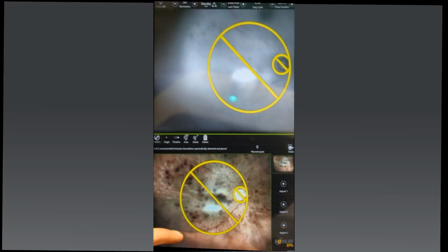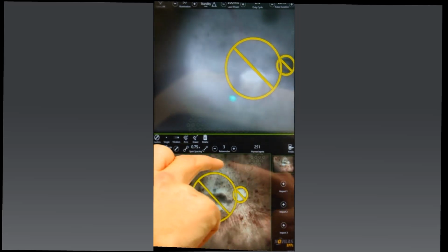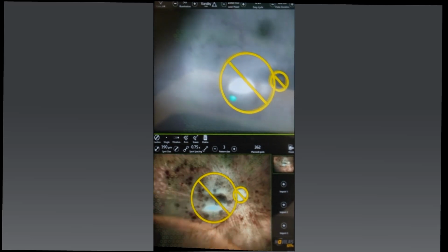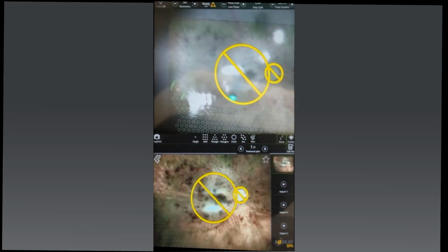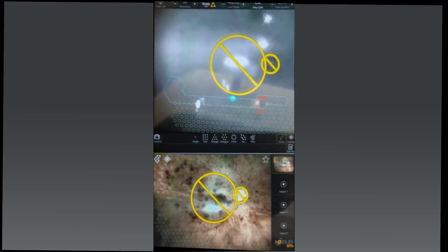This is a very ischemic retina. I was more keen to just get blanket coverage of laser on, basically to get good coverage. I was more concerned about this chap becoming increasingly rubeotic. He already had some rubeosis and raised pressure. So the goal here is to get as much PRP in place as possible. Perhaps not the easiest patient to treat, but not atypical by any means, because this chap was in a wheelchair. No, we've got a lot of these. This is becoming more common.